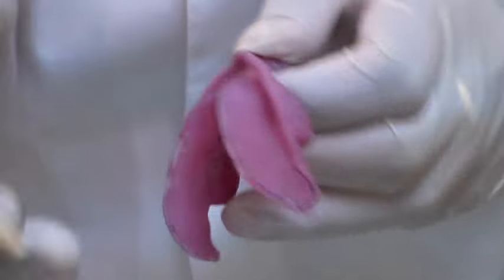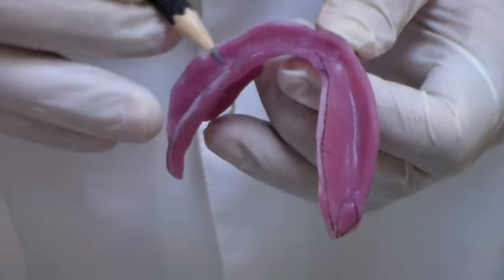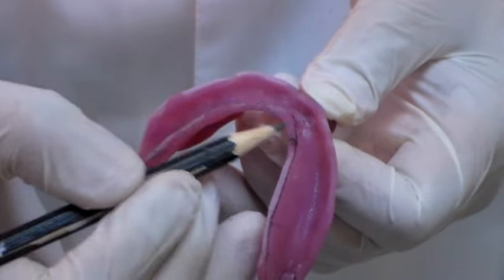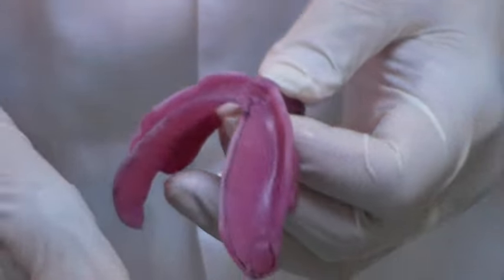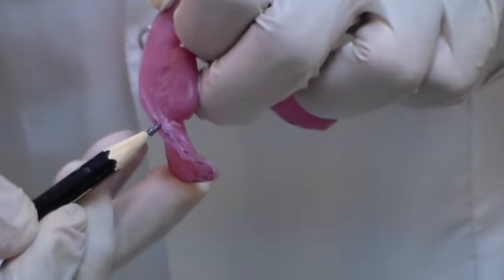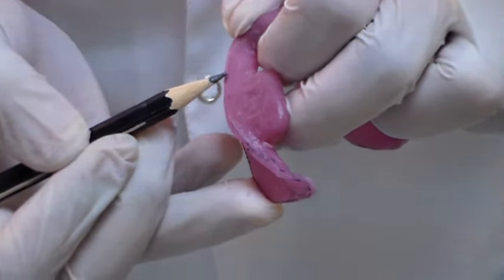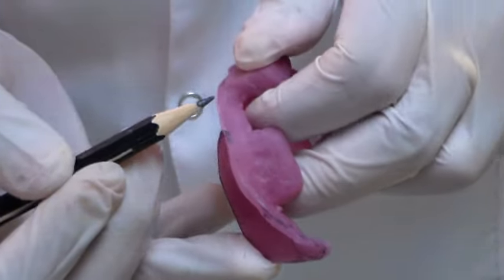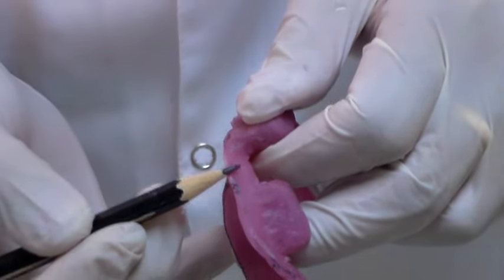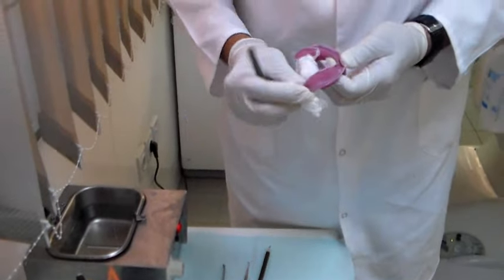The retromylohyoid region is what I'm going to mold first, then I will do the retromylohyoid region on the other side, then come to the pre-mylohyoid — what we would call the lingual sulcus — and then finally do the sublingual crescent. After this we go on to the masseteric notch area where the masseter muscle is going to work, then come to the buccal up to the buccal frenum, which will be the buccal flange, and then beyond the buccal frenum into the labial, which is called the labial flange.